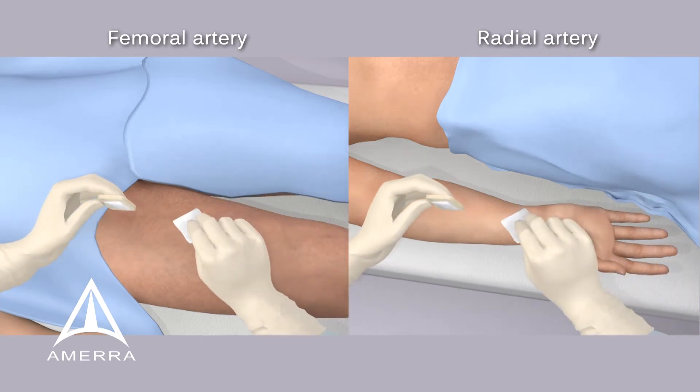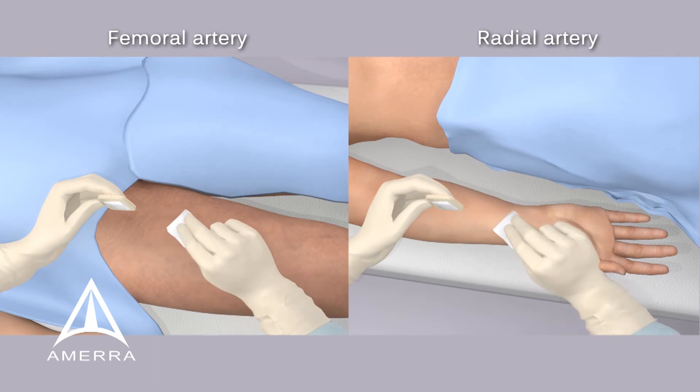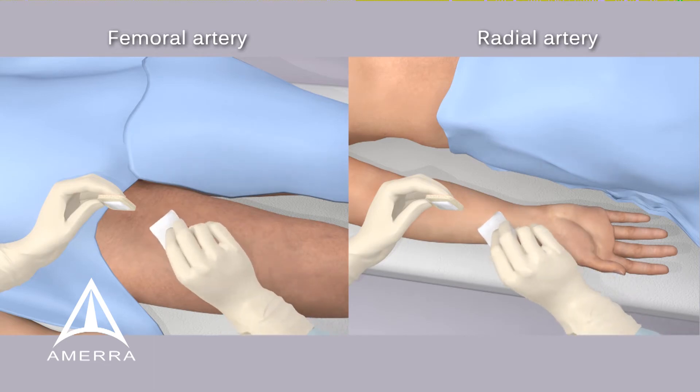After manual compression is complete, remove and discard the foam backing and remaining hemostatic gauze. Gently clean access site.